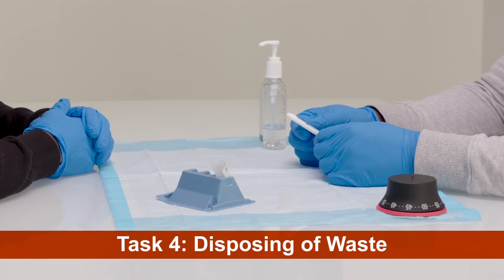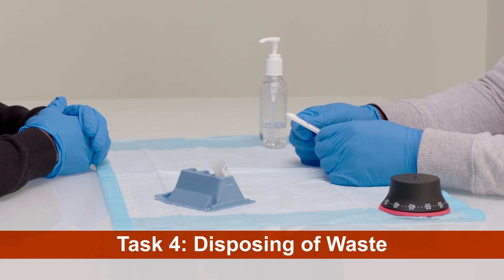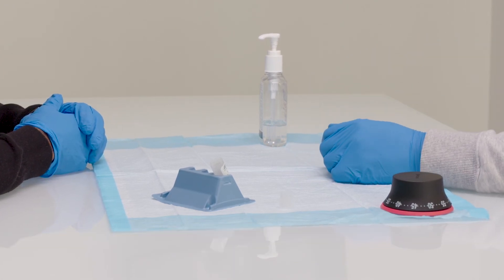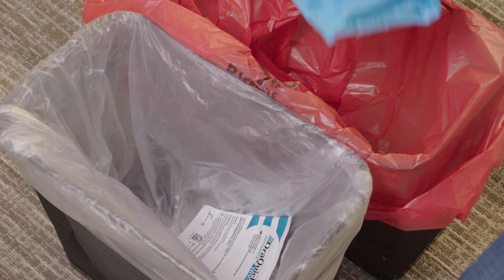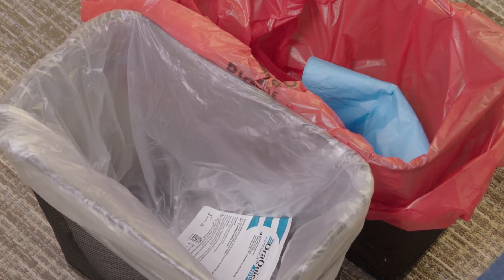After you discuss test results with the client, dispose of the single-use materials in the appropriate waste containers. Discard the test, recapped developer solution, and disposable gloves in a biohazard bag. Place the absorbent pad in the biohazard bag. If there are any spills, clean up with a 10% bleach solution.